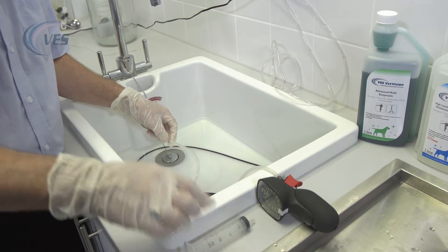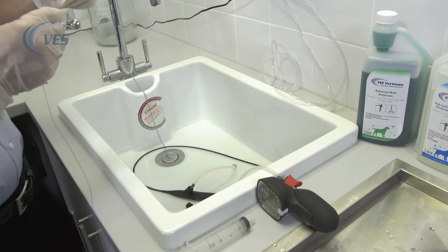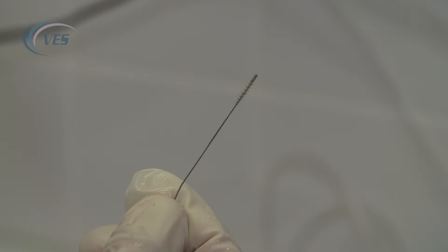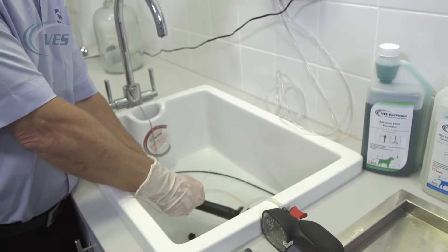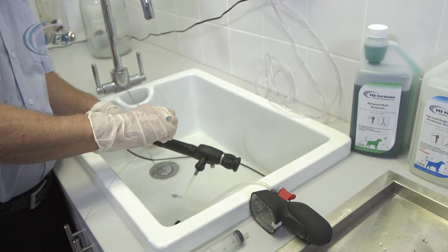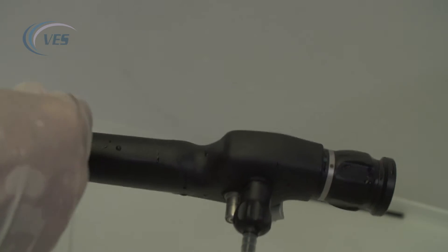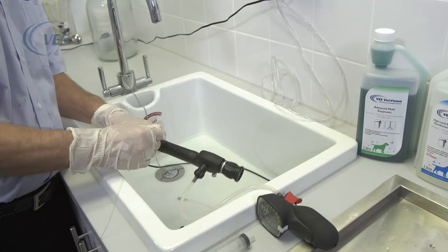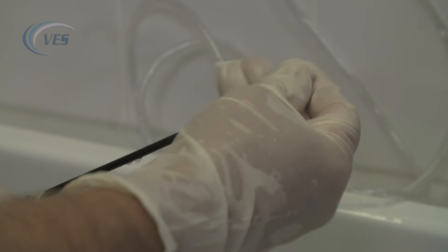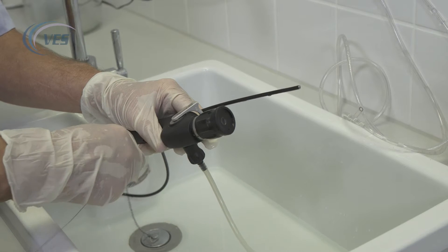The next thing we're going to do is to actually brush through the channel. We take our cleaning brush — the brush with the ball on the end — which is designed to push any pathology through the scope. We remove the flushing adapter and, as with the biopsy forceps, we feed the brush through with nice short strokes so we don't cause any kinks in the body of the brush, and it will emerge from the distal tip end. We clean the brush through of any pathology, and then withdraw the brush.